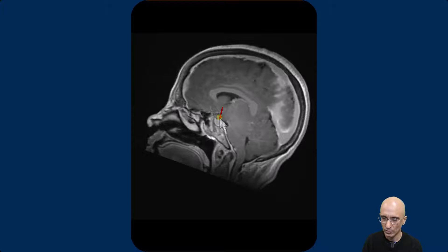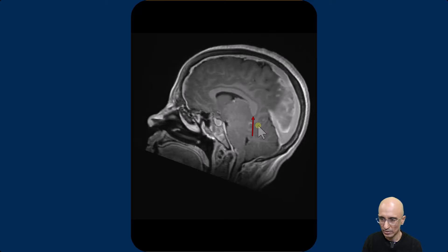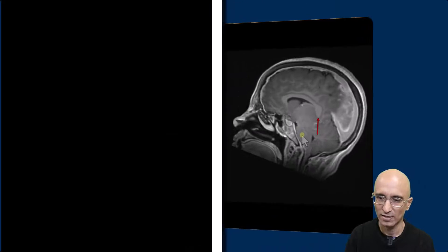You can also identify the distended pituitary gland, drooping of the splenium of the corpus callosum, also called the drooping penis sign.